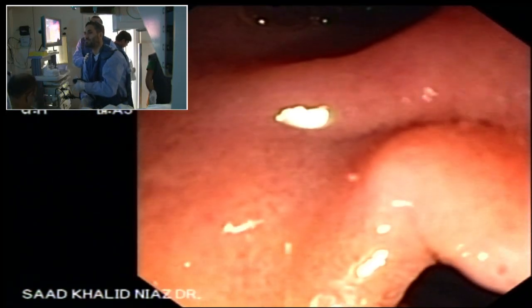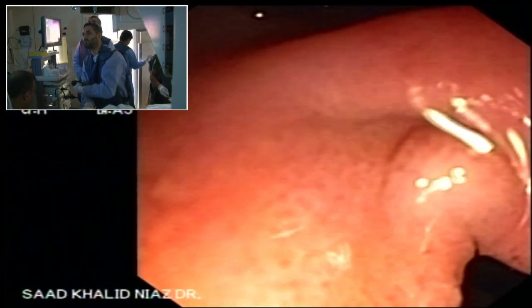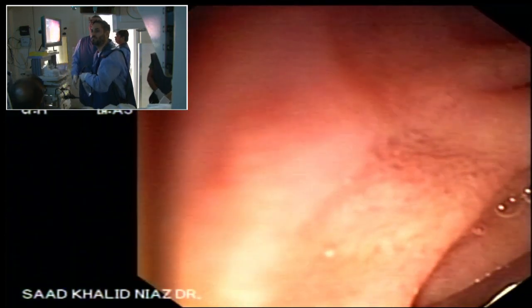Don't rush. Slow down, beta. You don't get anything by rushing apart from getting a perforation. So slow down, proceed gently. You are dealing with live human tissues, right? So just beware of that. It's not a dummy we are doing it on. Now, yesterday, if you saw us, we were asking you to hold the scope like that, not like that, okay? So always be in the right position. And the other thing is, don't force your scope. Let it go gently, right? So, yeah, that's fine. Right, okay.